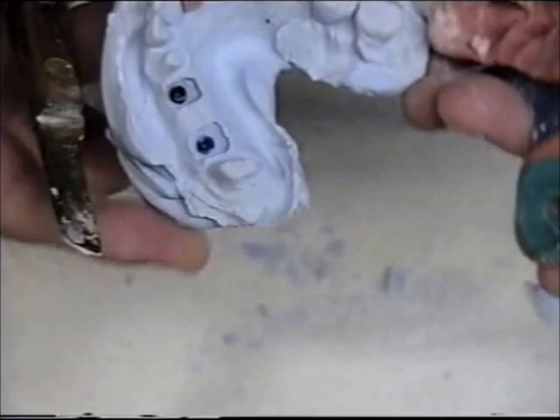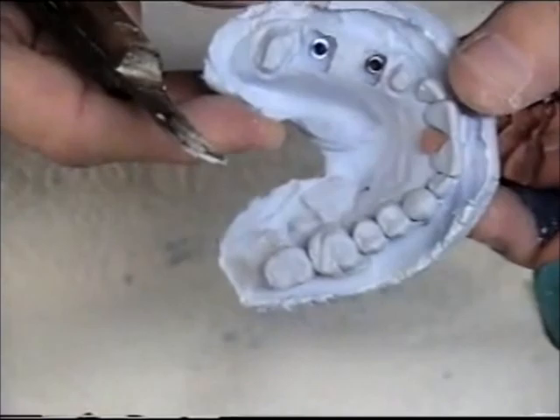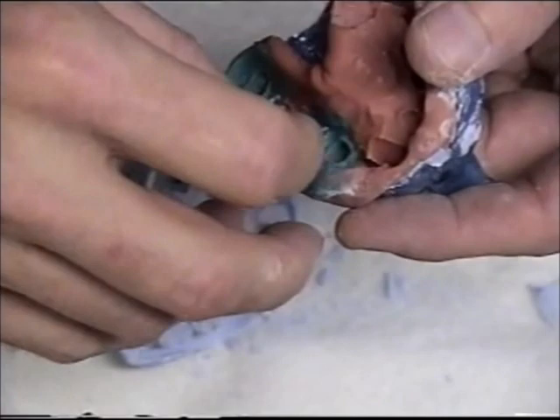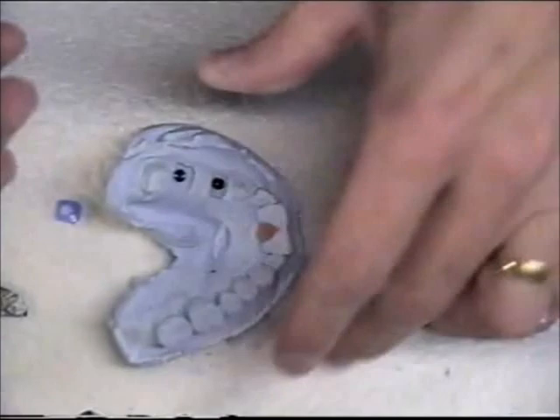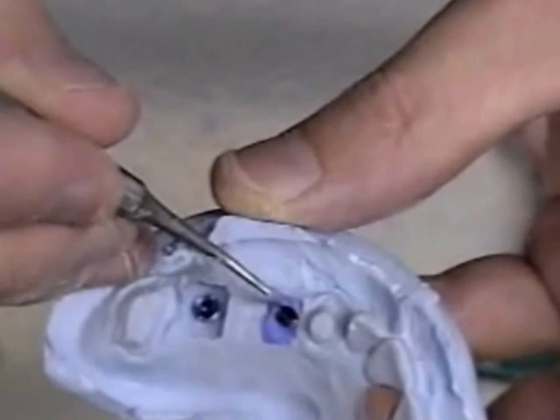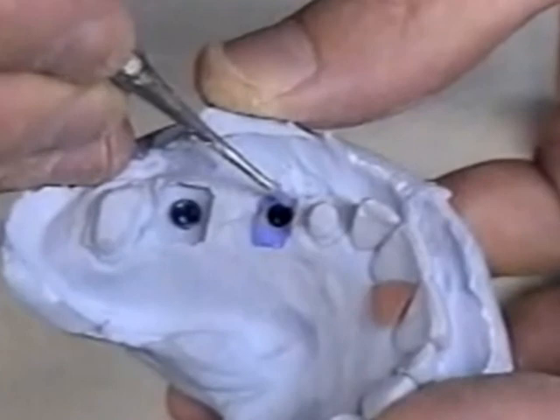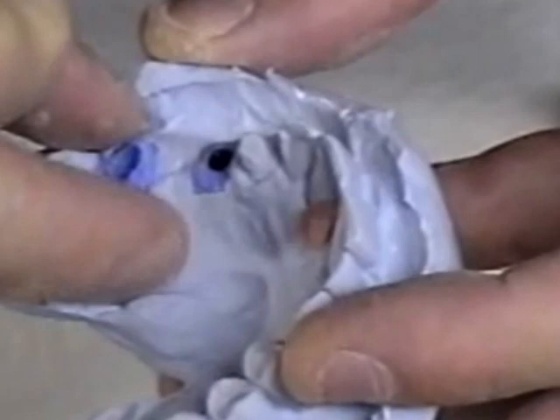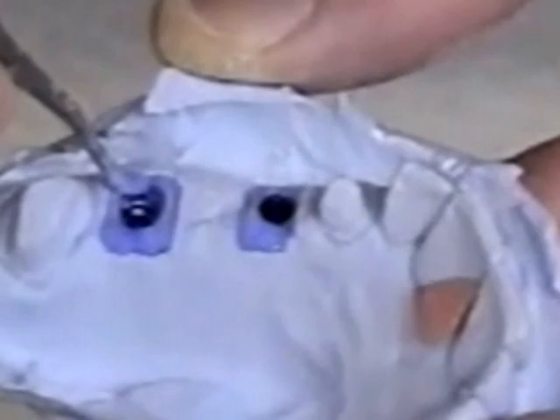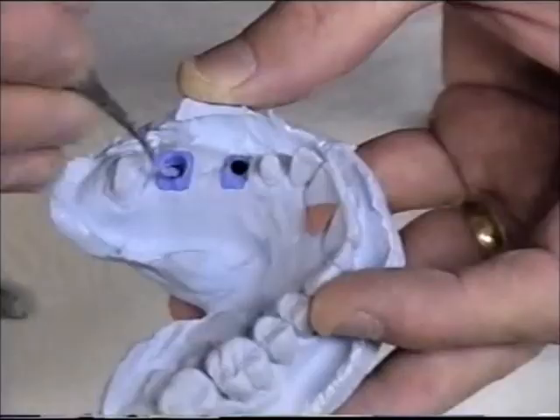Okay, checking all my teeth, make sure there's no bubbles. Margins look good, and I take my silicone soft tissue areas here. They come right off the impression material. Place those in place nicely. Here we go.